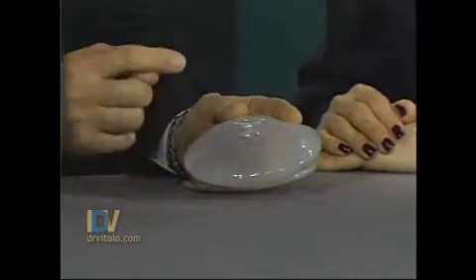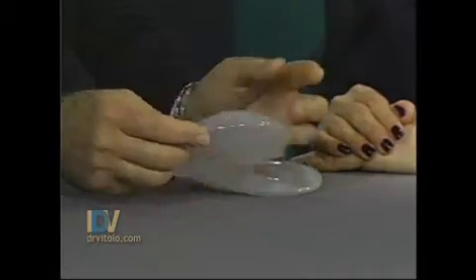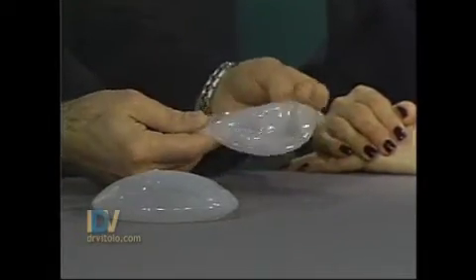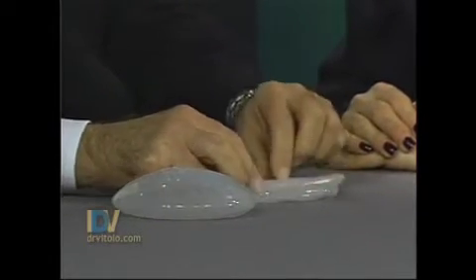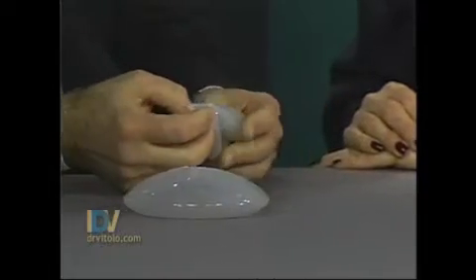So what we do is we take an implant like this that has a self-sealing valve in it. We put a plastic filler tube into this valve, and we remove all the air. The implant now becomes flat. We roll this implant up, with the tube inside of it, and we make an incision through the belly button. We tunnel up underneath the skin, just right underneath the skin, not inside the abdomen. We slide this up until it sits underneath the breast tissue. And then from outside the body, like the old ship-in-the-bottle technique, we inflate the implant. So now it becomes like that.